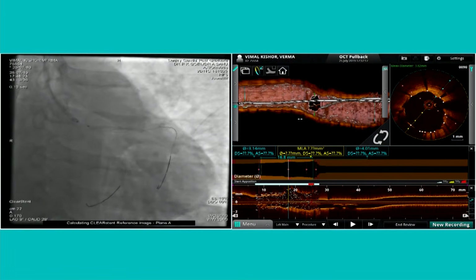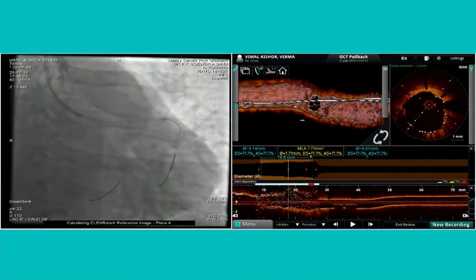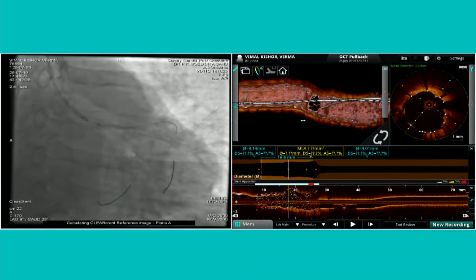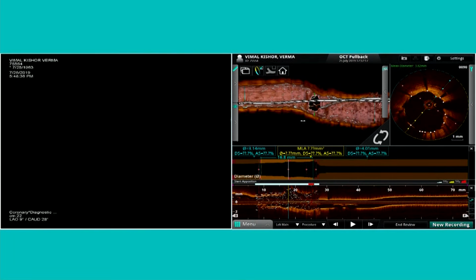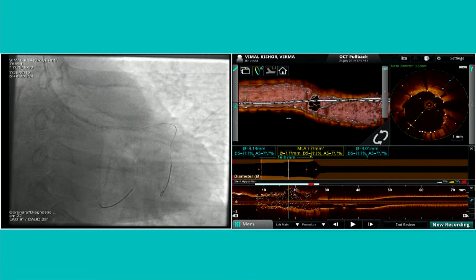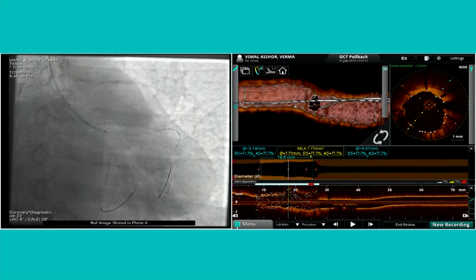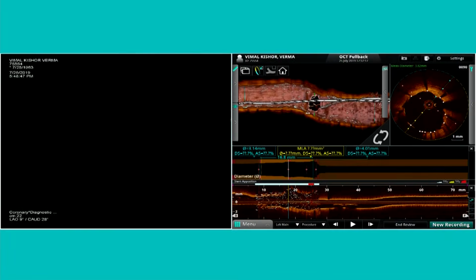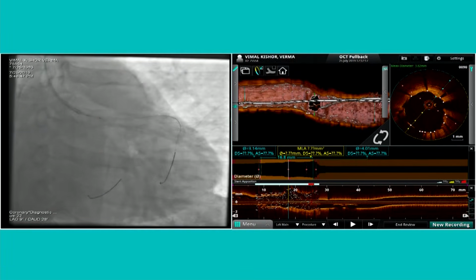Overall it's a very good result, but still there is something to do at the very proximal edge of the stent. Another important thing while doing POT is to see what the distal extent of the balloon is. You are supposed to be just onto the proximal part of the LCX origin. Do not cross the LCX totally, so that there will be less problem for the LCX when the left main stent expands well proximal to the bifurcation.